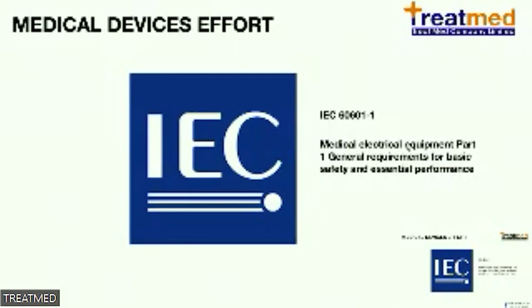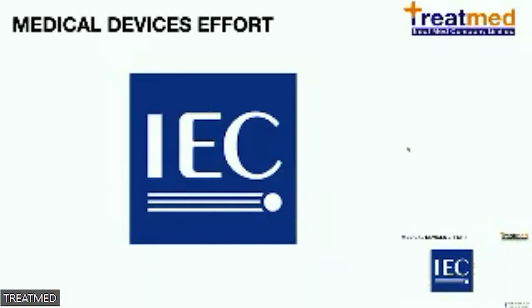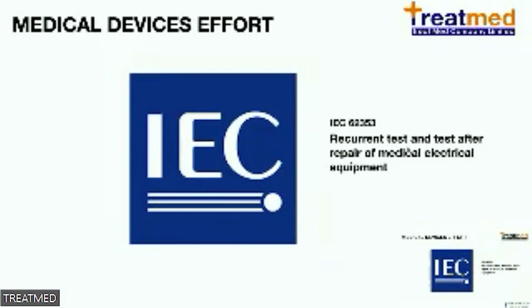The first is the IEC 60601, which we use for the acceptance test. The first time we test a medical device, we use the IEC 60601. And then when we have used the medical device for a year or two, we change the electrical safety standard to the IEC 62353, for the recurrent test and the test after repair of the medical device. We use the 62353.